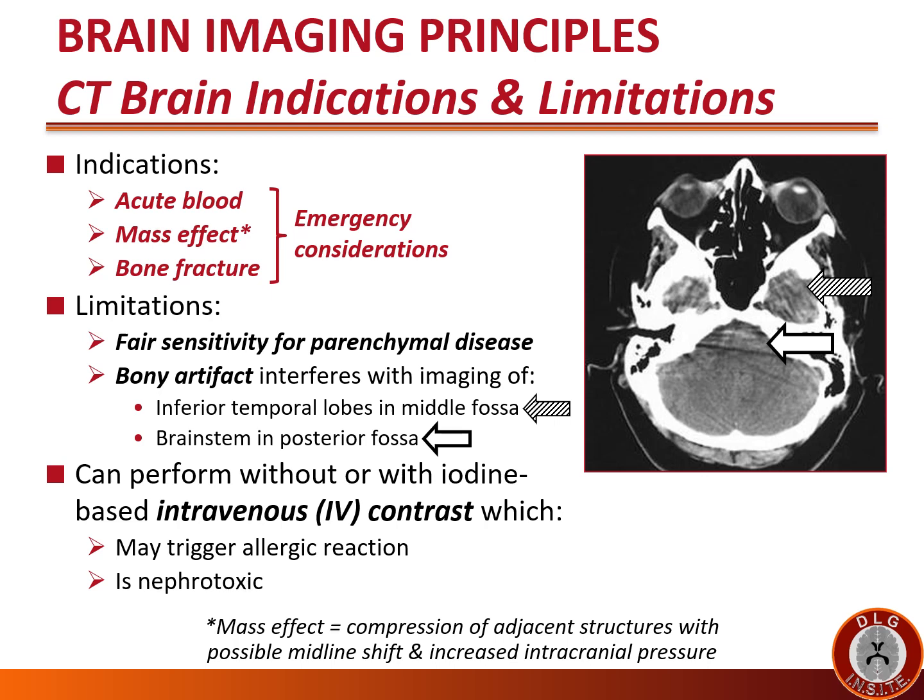CT brains can be performed without or with iodine-based intravenous or IV contrast. And this IV contrast may trigger allergic reactions and is also nephrotoxic. So contrast scans are best obtained when patients have normal renal function.